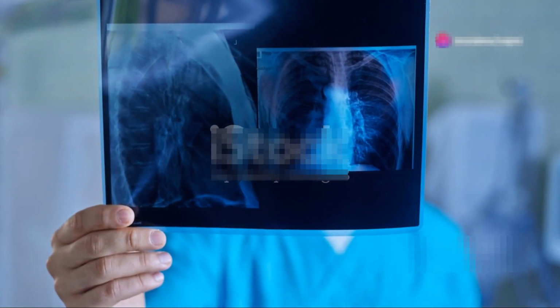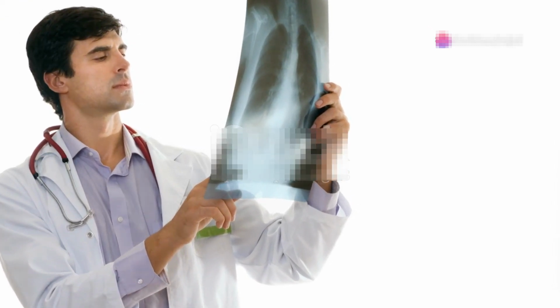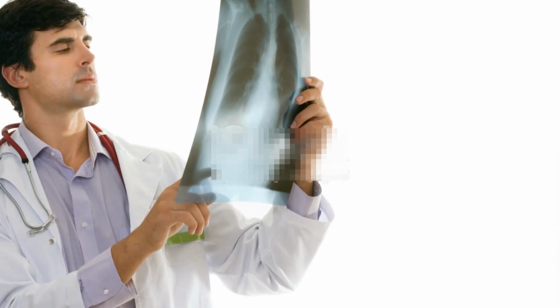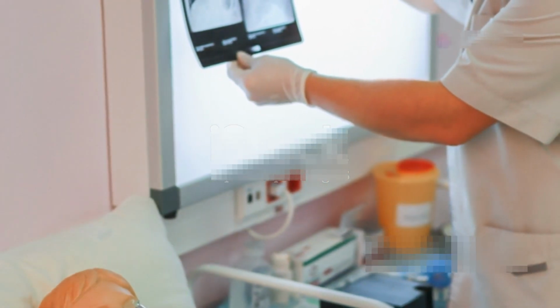Low PaCO2, hypocapnia, if it's below 35 mmHg. Hyperventilation, for example, anxiety, panic attacks, pulmonary embolism. Symptoms: lightheadedness, tingling in extremities, palpitations.